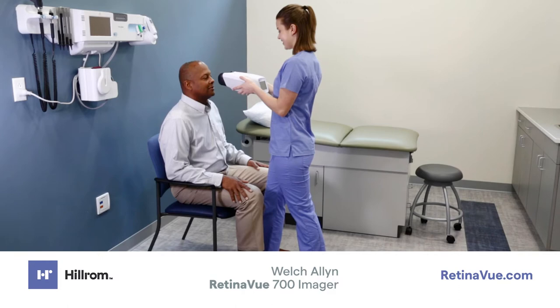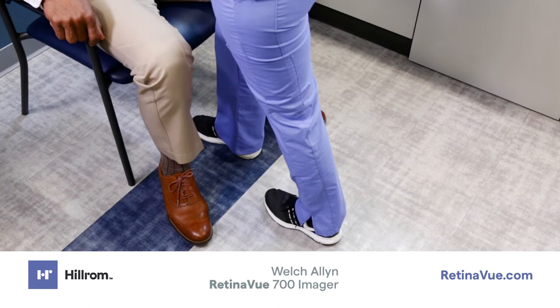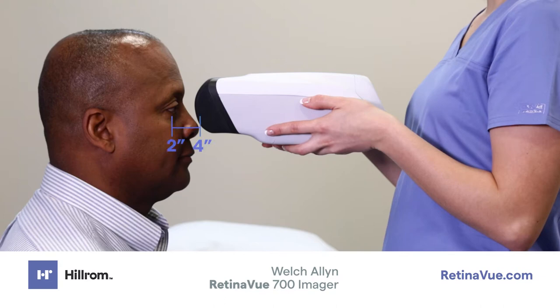Positioning yourself to acquire an image. Position yourself in front of the patient. Hold the imager with the screen facing you. Be sure to grip the imager firmly and in a position that allows your thumb to reach the touch screen. Place one foot in front of you close to the patient. This will allow you to move the imager toward the patient's face in a controlled and stable manner. Hold the imager two to four inches directly in front of the patient's eyes. Brace your arms against your body to help keep the imager steady.